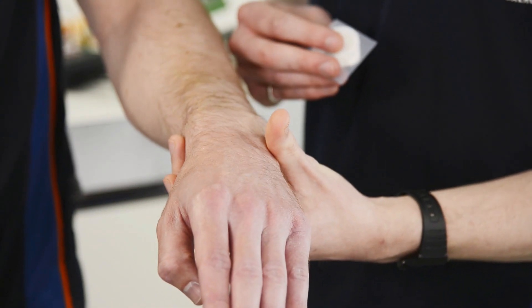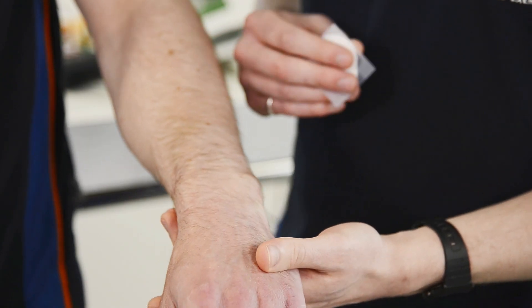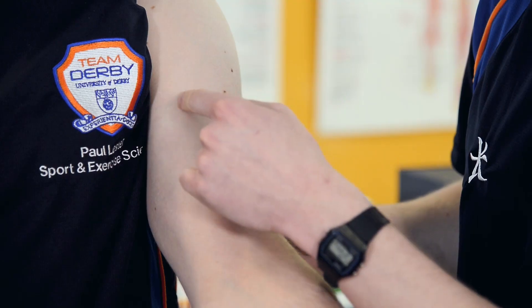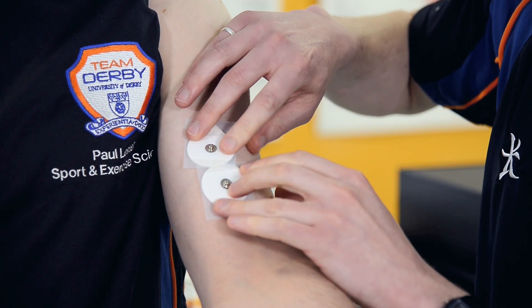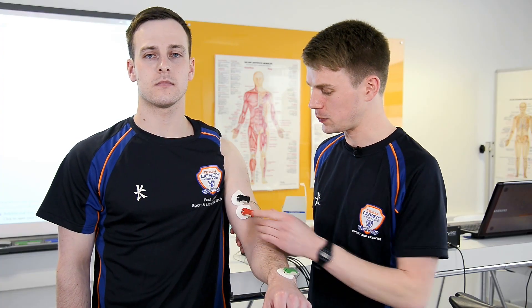One is usually called the reference electrode. It's called this because the muscle activity is measured with reference to the activity here. Therefore, it doesn't want to be placed on a muscle, but over a bony landmark, such as the wrist. The other two electrodes are placed over the belly of the muscle, in line with the muscle fibre.